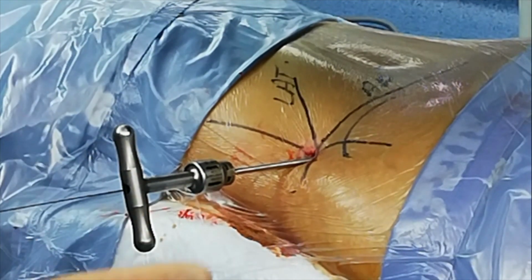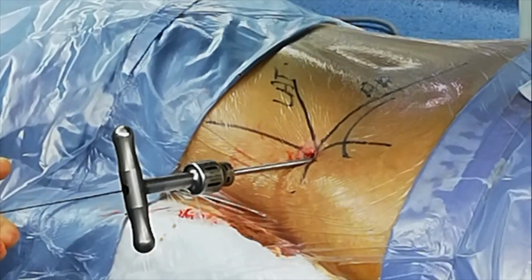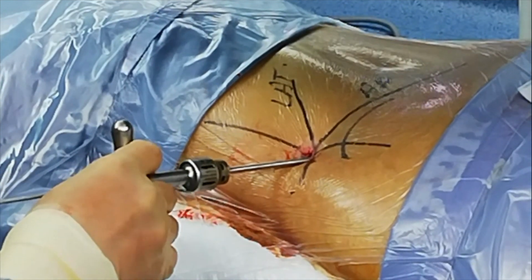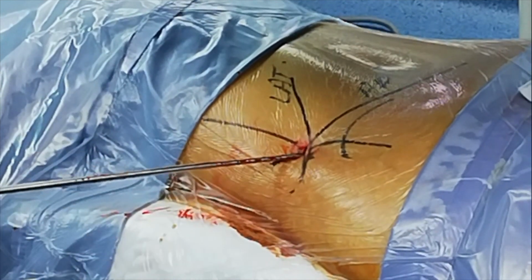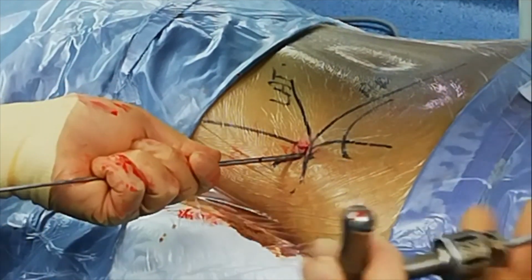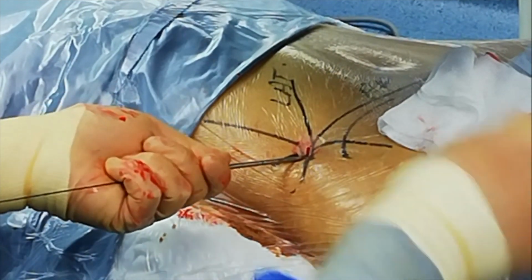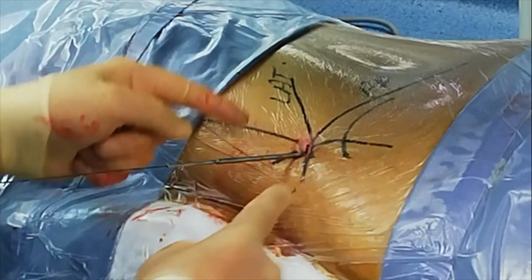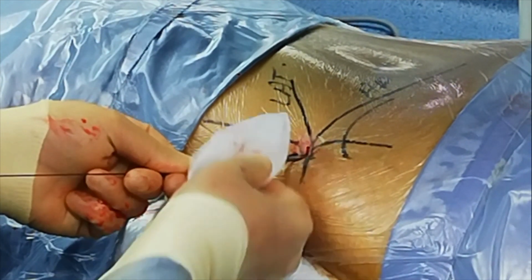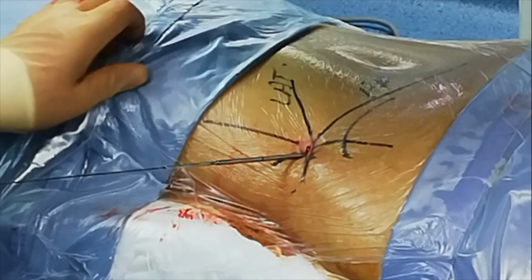Remember, this is a young patient. She's 47 with a very good foramen, so reaming is minimal here. It's really to facilitate docking of the cannula eventually in the lateral recess. So remember, I've reamed for the sleeve reamer, so the green reamer went onto the green sleeve. So I pushed the green sleeve because it's already been reamed for.